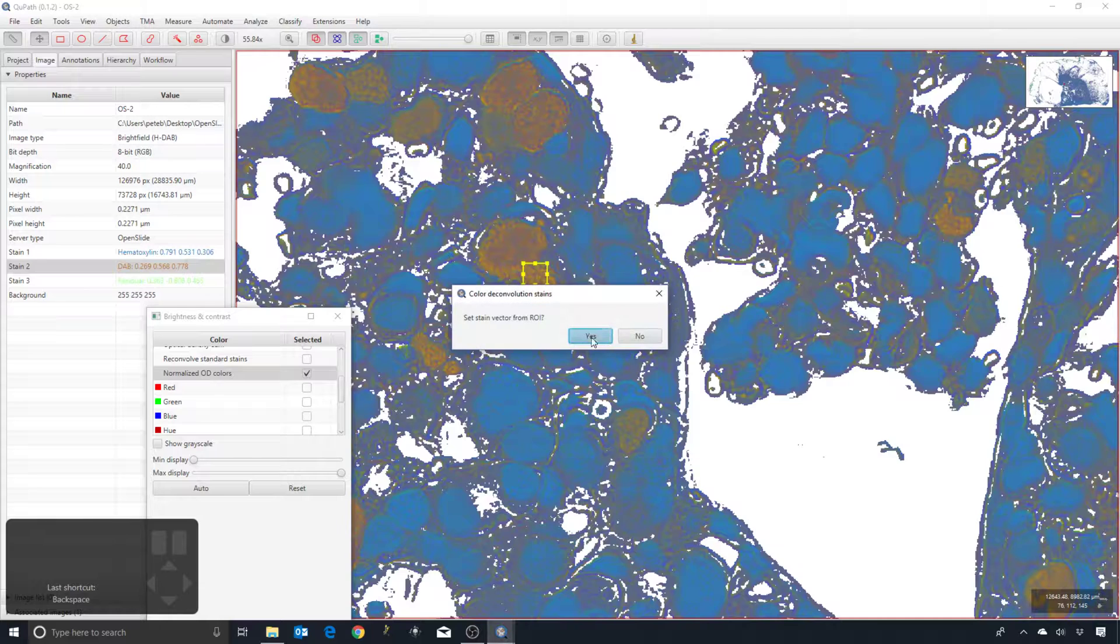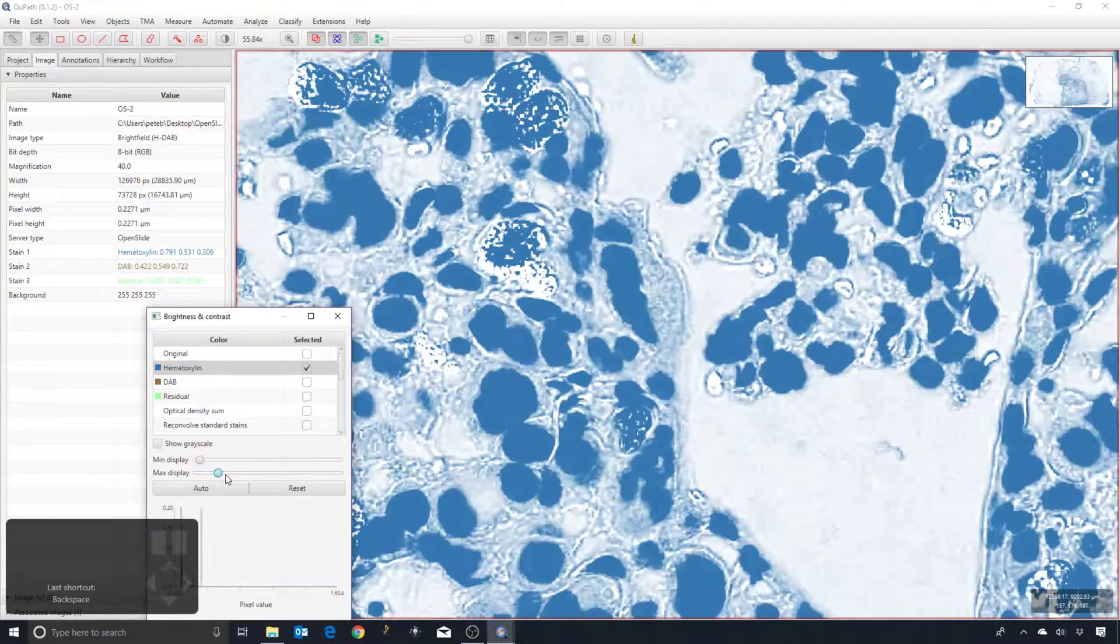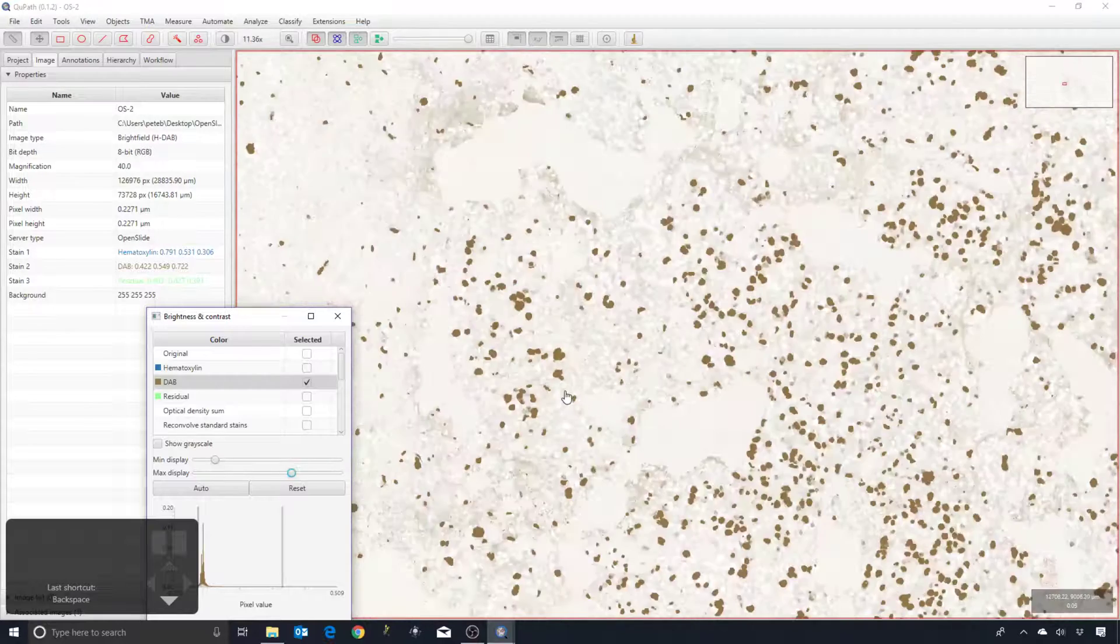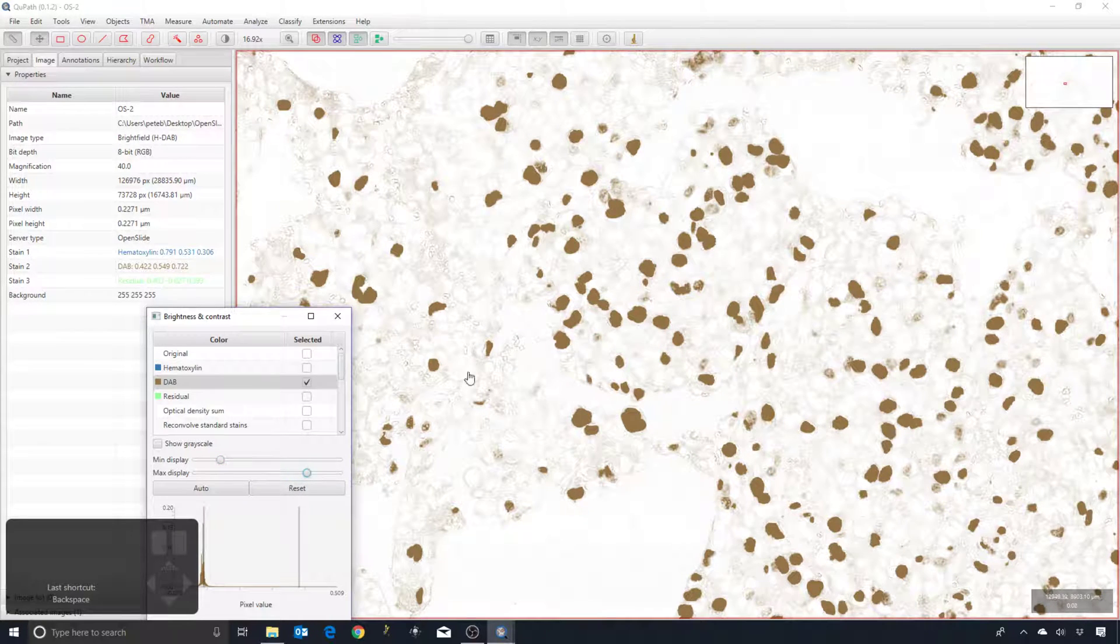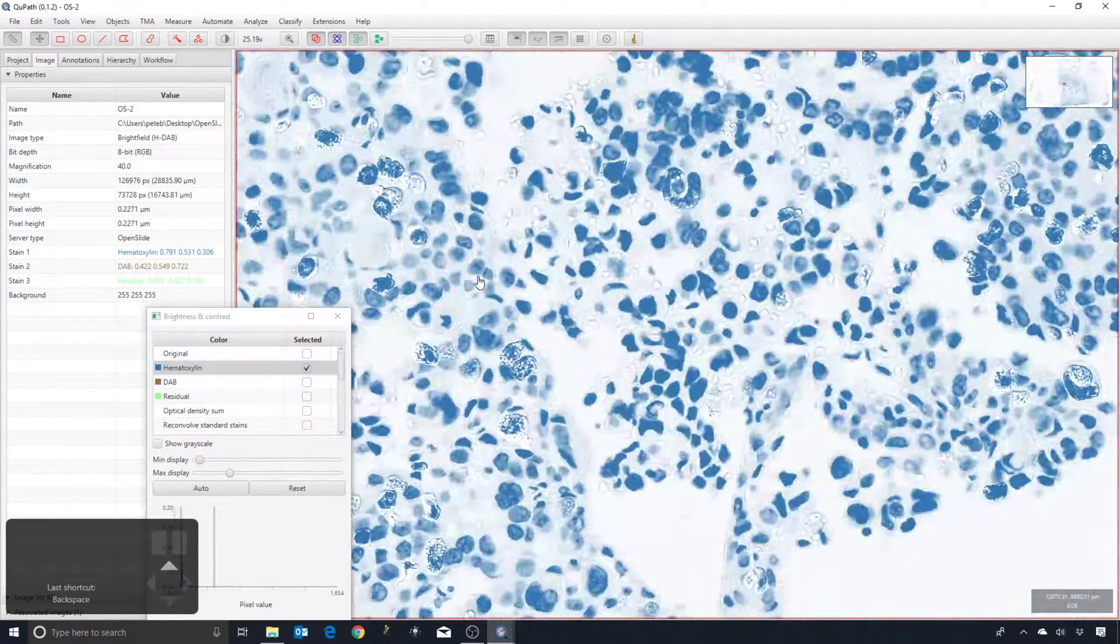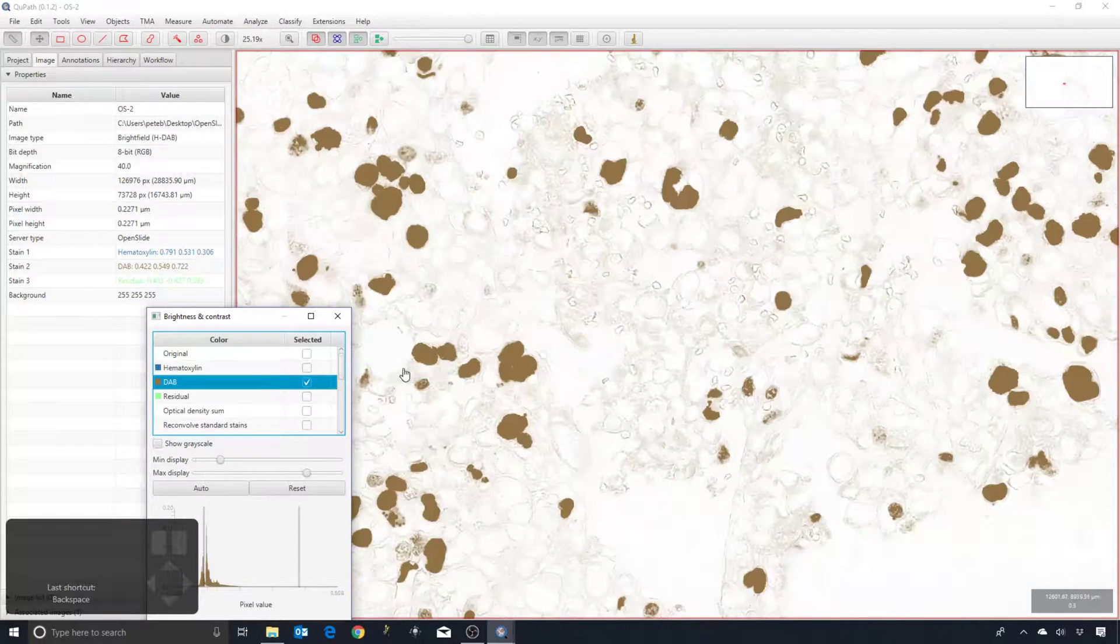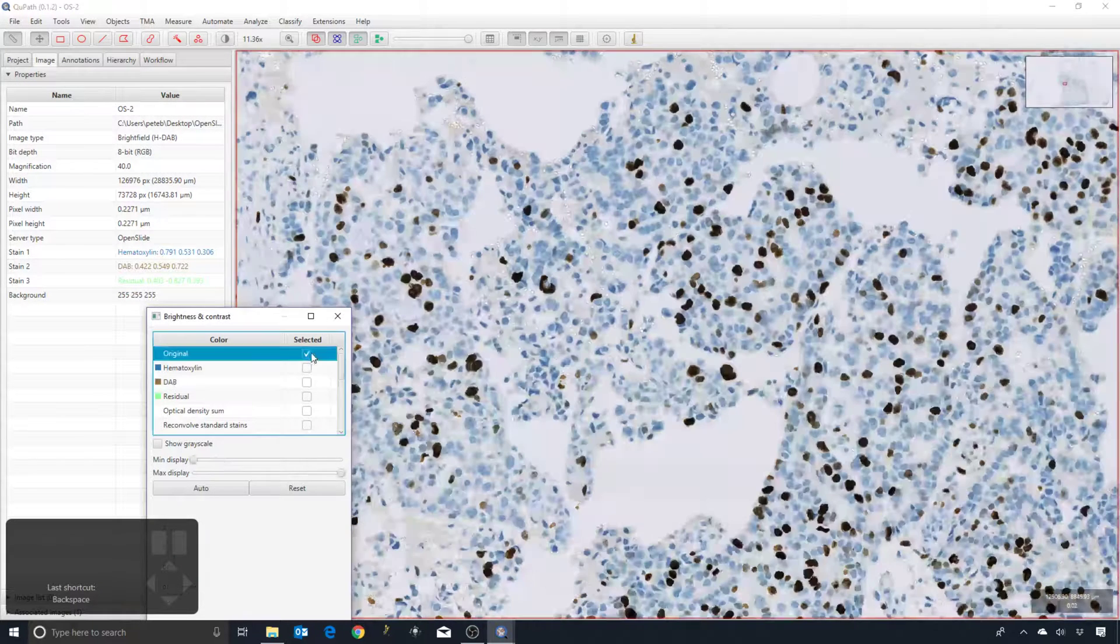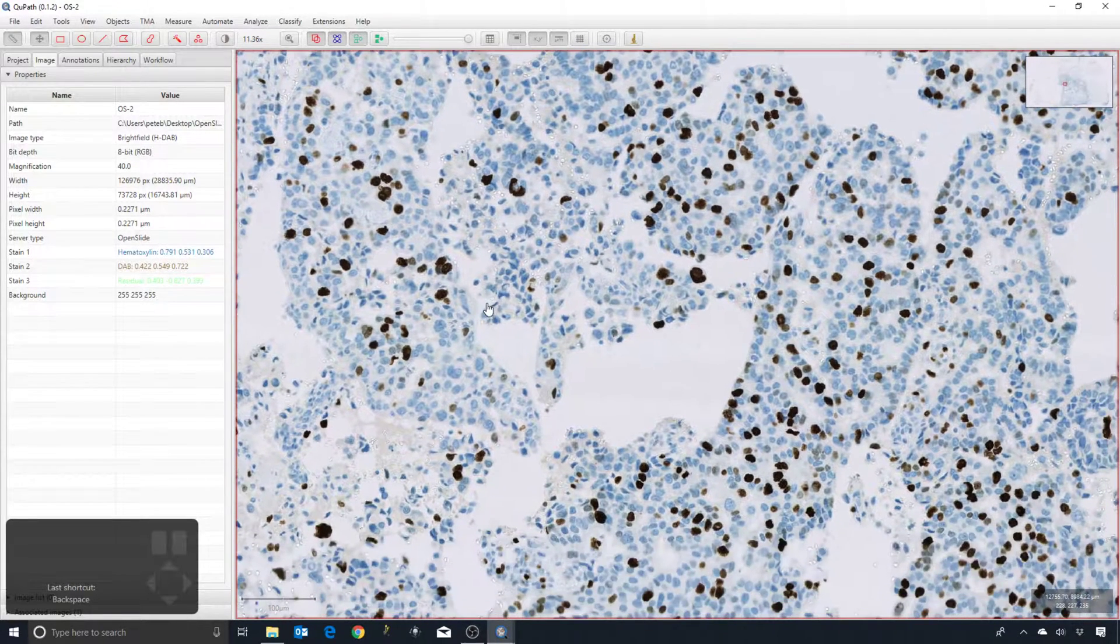I double-click on that, set the stain from the ROI, and then I may need to adjust the brightness and contrast here to the channels now that I made that adjustment. We can see that we have got a slightly different stain separation than what we had before. Again, we shouldn't overestimate the accuracy of this. You can still end up with some strange things like negative values or mixtures of stains that aren't entirely as you would expect. But still, you can see that in the positive cells we clearly have higher values for the DAB as opposed to the hematoxylin, so it's enough that we can at least work with it.